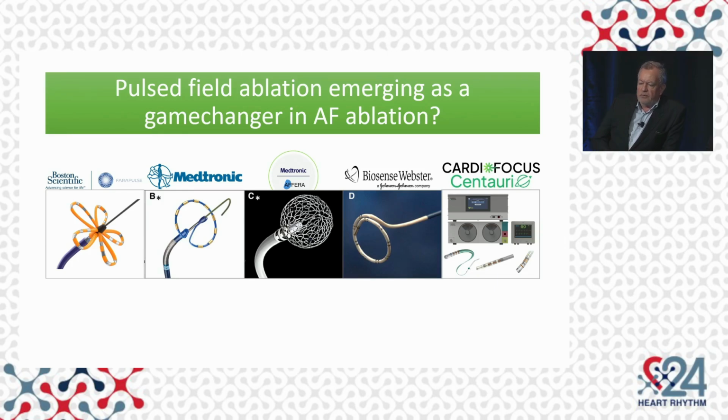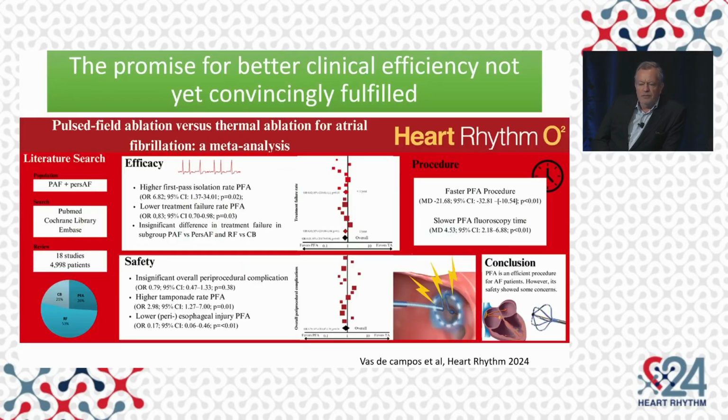PFA holds a great promise for ablation due to the potential for myocardium preferential ablation, but it has been difficult, honestly, to fulfill that promise in terms of better clinical efficacy.